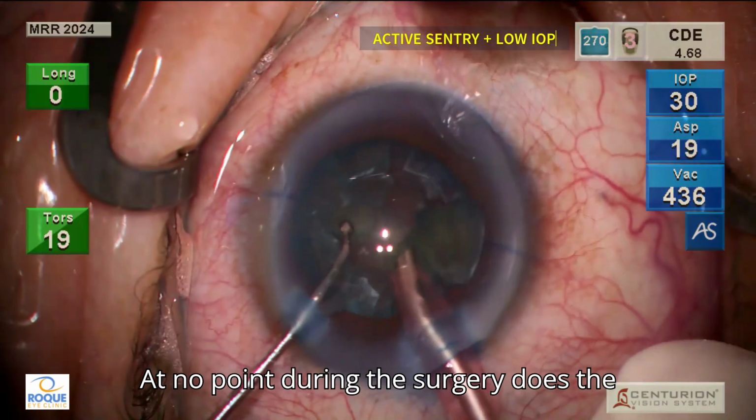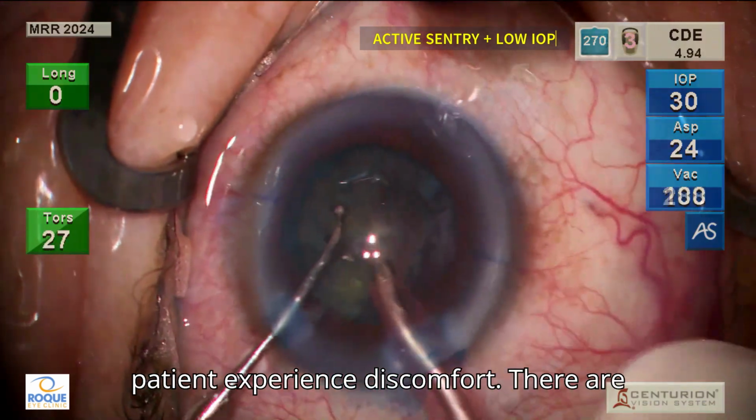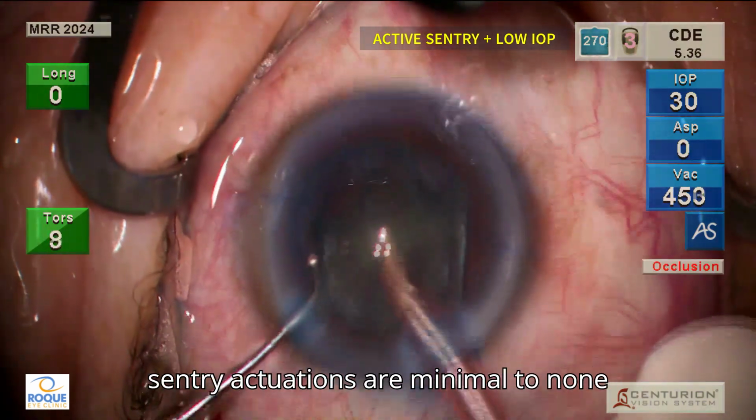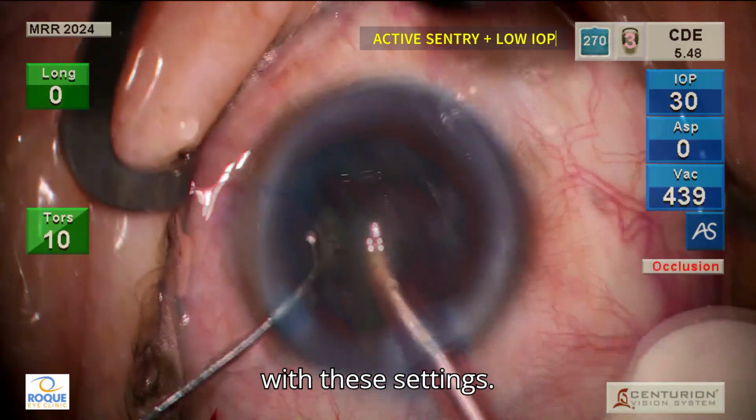At no point during the surgery does the patient experience discomfort. There are no post-occlusion surge episodes. Active Sentry actuations are minimal with these settings.